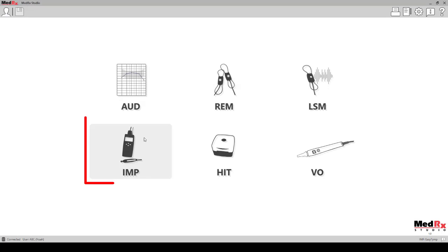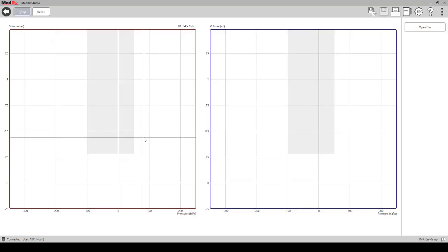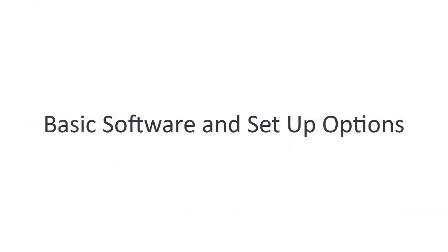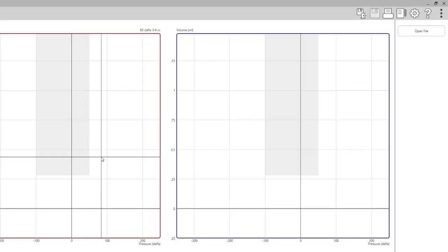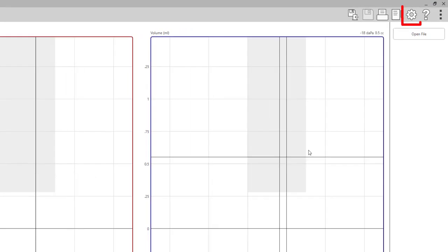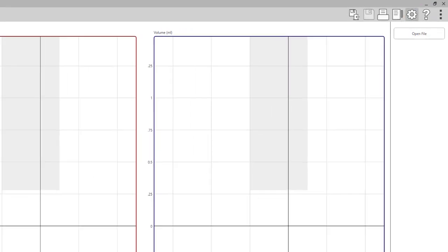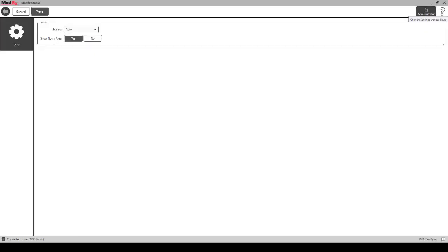Select the impedance module, basic software and setup options. Select the show settings icon in the top right corner of the screen.